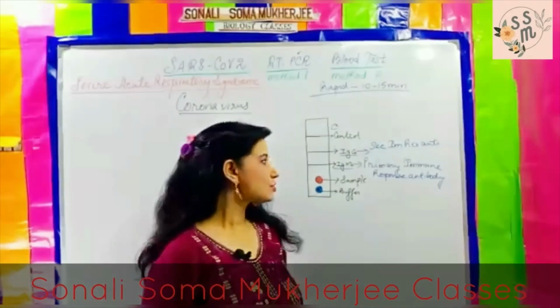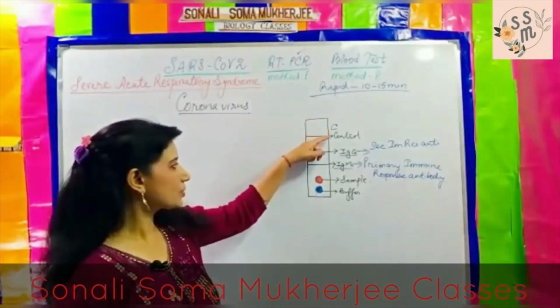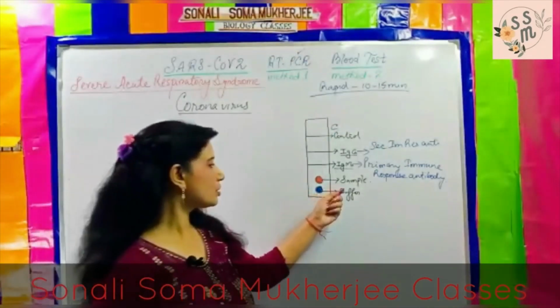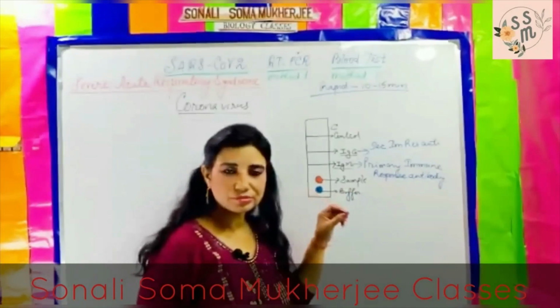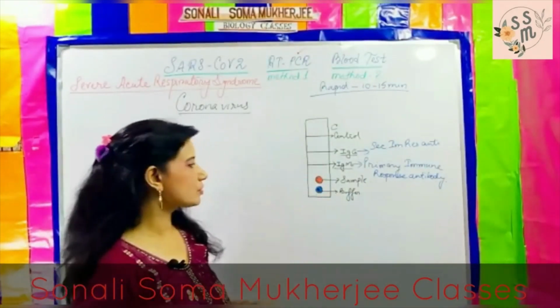As I have said, it resembles the pregnancy test kit, and there is a control line you can see. When you run the test, you put a little bit of blood sample over here in this region, which stands for the region of sample, and then you put a little bit of buffer. The kit is supplied with a buffer solution.